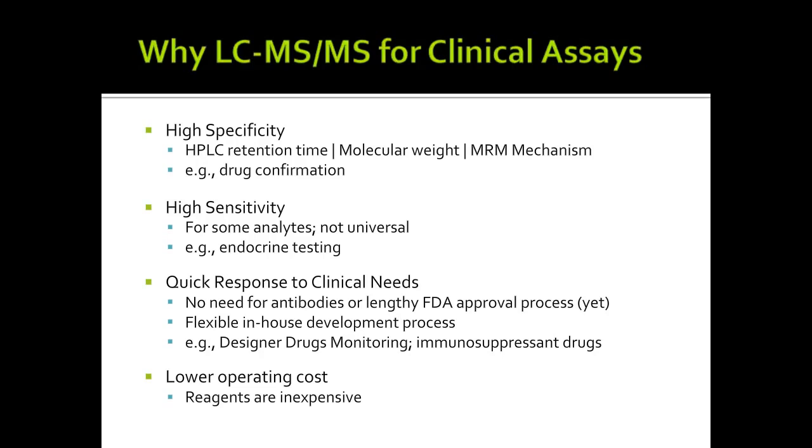And the third part is probably the most discussed, which is the quick response to clinical needs. What does that mean? That means that, different from immunoassay, which requires development, selection and perfection of the antibodies, and also a mostly lengthy FDA approval process, at least for now. We don't know what's going to happen yet in the future.